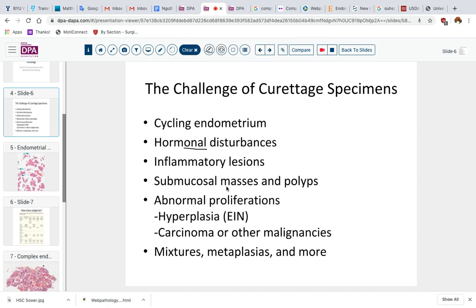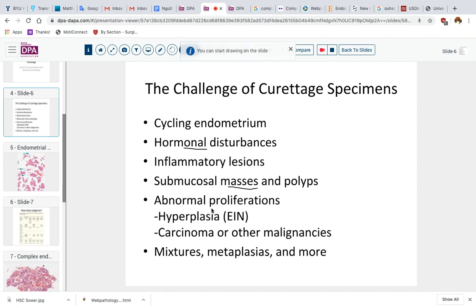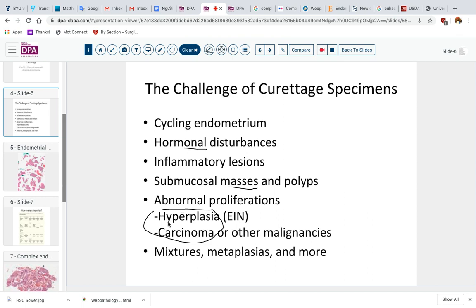We can have submucosal masses — polyps, leiomyomas, and those sorts of things that can create bleeding symptoms and enter into our differential. And then the most vexing issue is, of course, the hyperplasia and carcinoma issues that people are often most anxious to exclude. And to make matters more interesting, they can be mixed up — you can have several of the above, and that presents challenges.